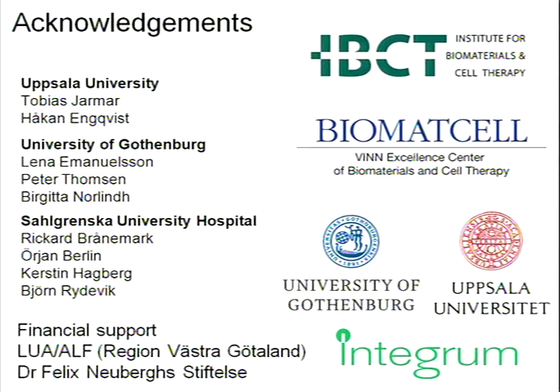As a material scientist, I think it's quite difficult to answer the biological part, and I don't know if Professor Thompson has something to say about it, but there is a difference in load situation between the dental implants and orthopedic, and that will affect in one way. There is also a difference in bone type, trabecular bone, cortical bone, and what the cells are saying and doing close to the implant.